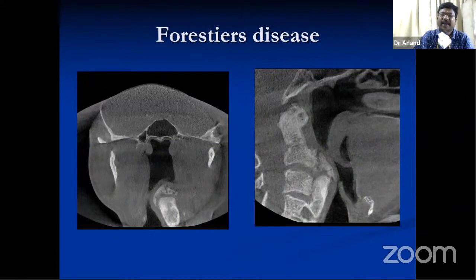And it is the duty of a radiologist not only to look into the dental structures. When you look out for a field of view which covers both maxilla and mandible, or certainly a larger field of view from the skull area to the neck, it becomes the duty of radiologists to look out for structures that are covered in the scan. You cannot just simply say that you can visualize only the maxilla and mandible, because as it is being covered in the scan, it should be visualized. So earlier I told you about the osteoma in relation to the frontal sinus.